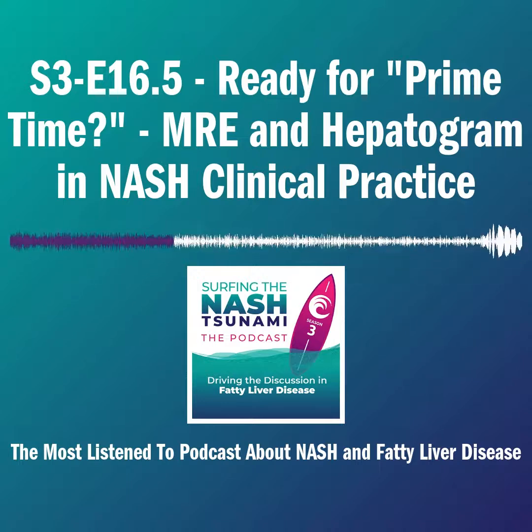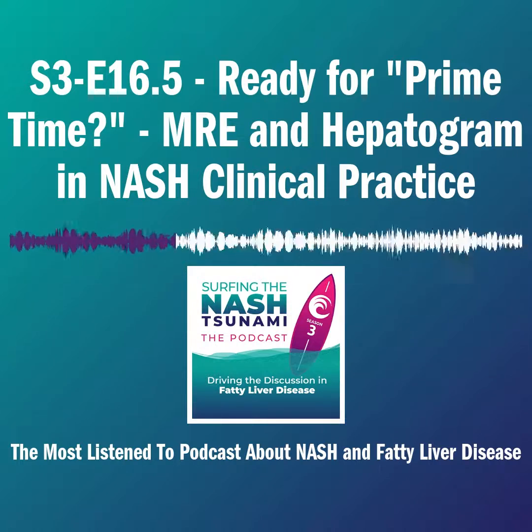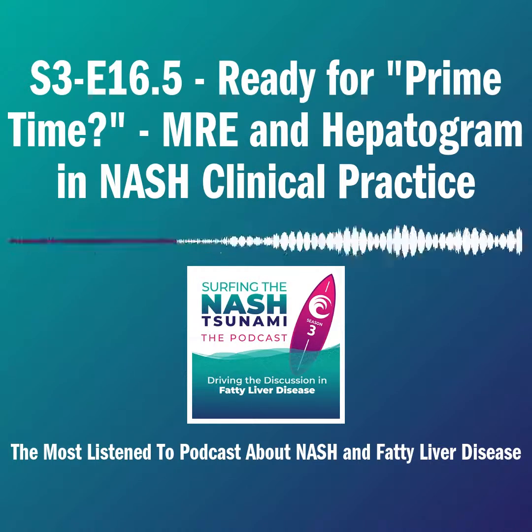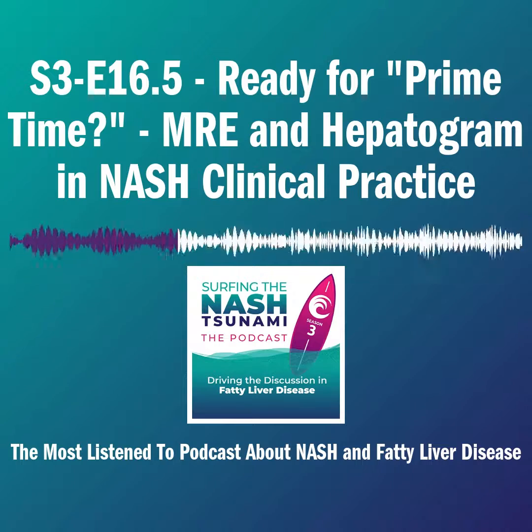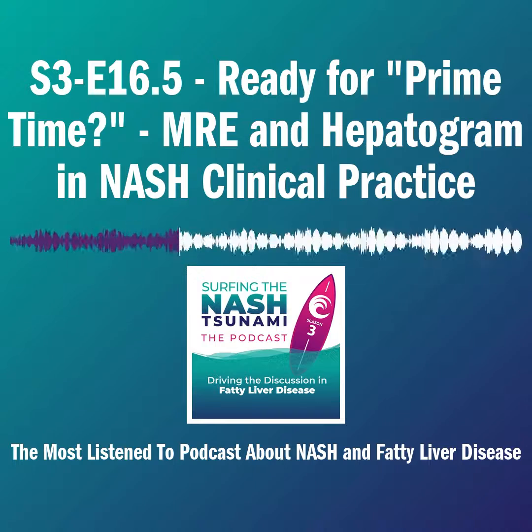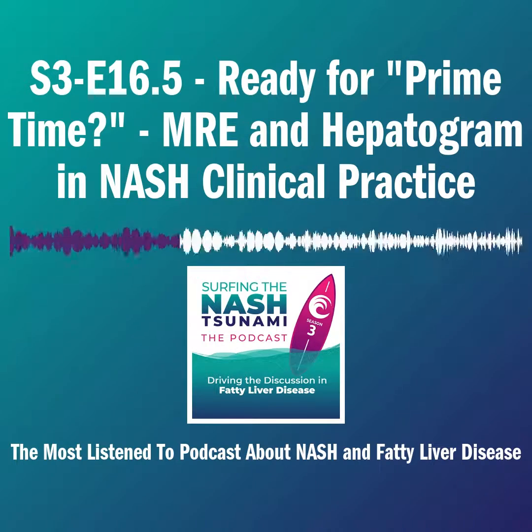Our original uses for this, interestingly, came from children. Our pediatric hepatologists are reticent to biopsy children with suspected NASH. The way that we started doing this is that when the children underwent anesthesia for their biopsy, we would bring them to the MRI suite first, do PDFF and MR elastography, then take them to the interventional suite to do the liver biopsy, which was great because we learned a lot that way, as we could correlate the biopsy findings with MR elastography. And no surprise, we found really terrific concordance. And then, as the patients were being treated, we would use the imaging only to track the patient.